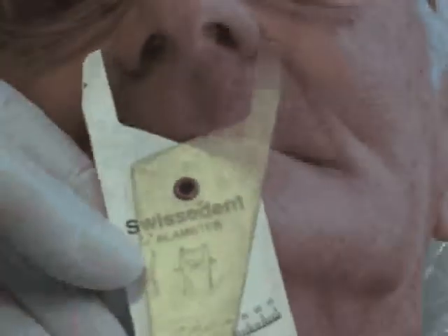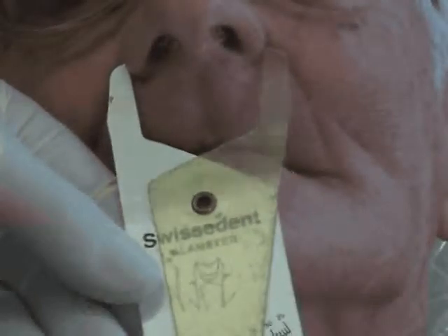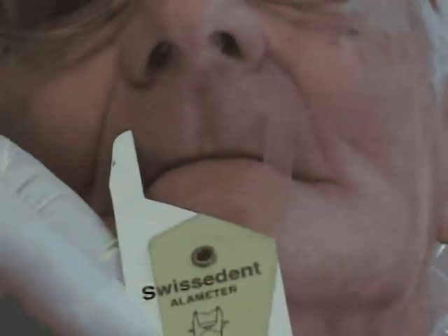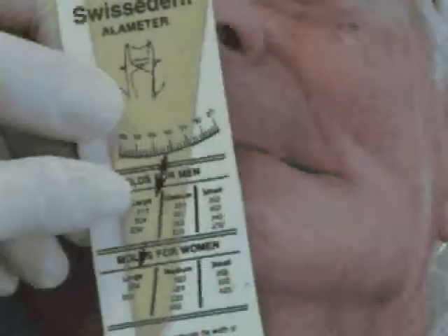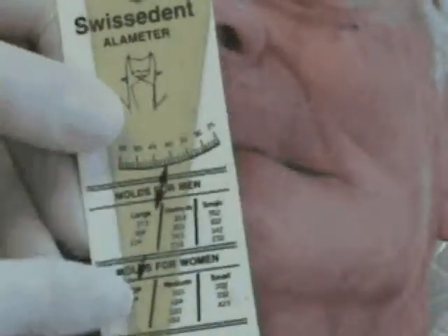Then, to give us an idea what size teeth to use, we have a meter. You can just relax. We're measuring the alae of the nose. And that measurement actually falls dead center in the cuspids. When you bring it down, that's dead center in the cuspids. And then when we do our reading, where it points, we know that this patient is going to have relatively wide teeth. And there's a large selection of teeth that fall into this area.